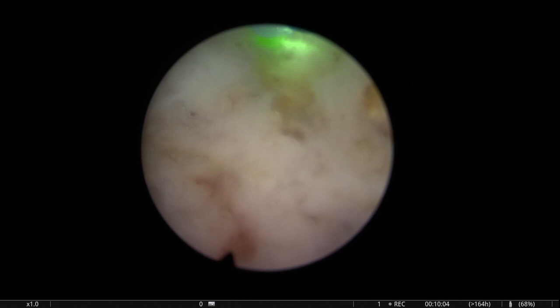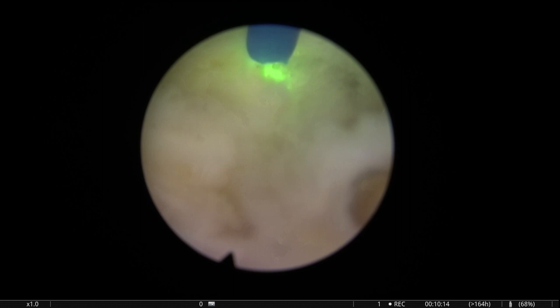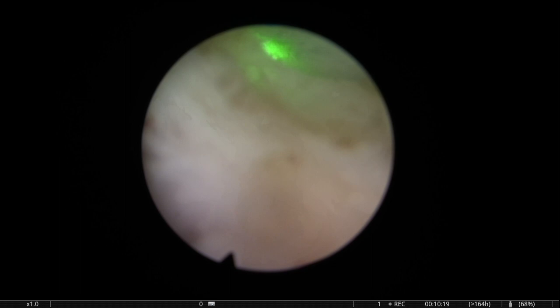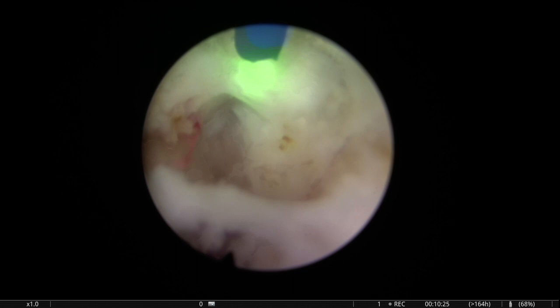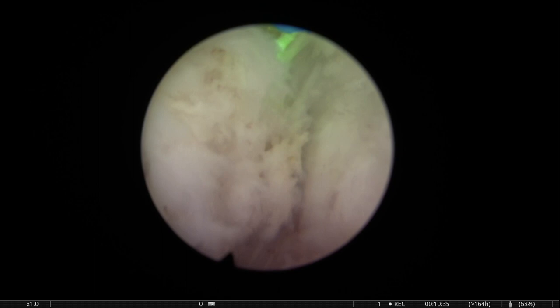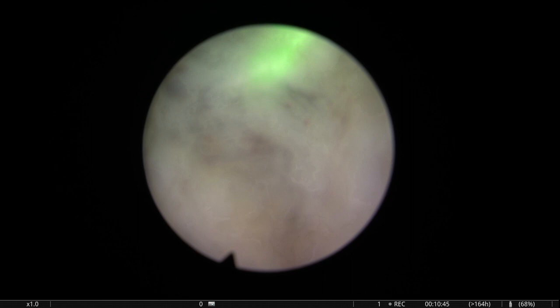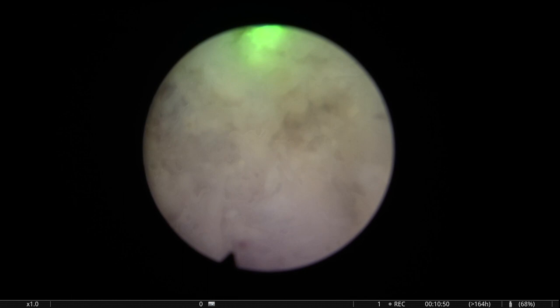If you see him operating, it looks as if he's going slowly and he's doing small increments, small dissections here and there, and he tells you, we have to go millimeter by millimeter. And I inherited this phrase from him because I think in this endoscopic enucleation, as well as in robotic prostatectomy, many times you have to gain 1 millimeter at a time, to start liberating the tissue, to make it possible. So you shouldn't get frustrated, just get things a little better each time, advance a little bit, and step by step, I think you will get to a successful end.